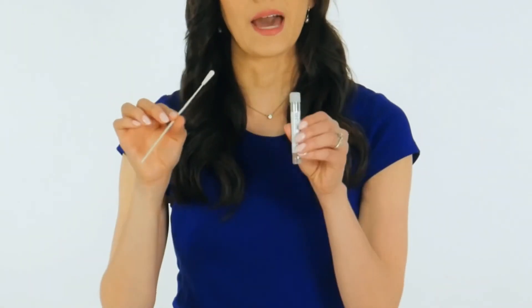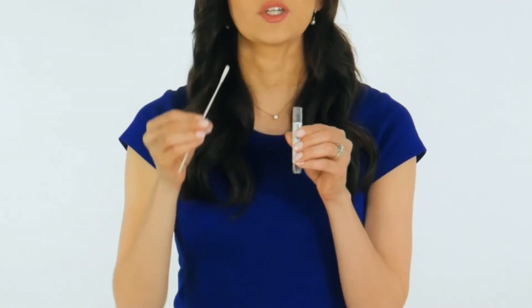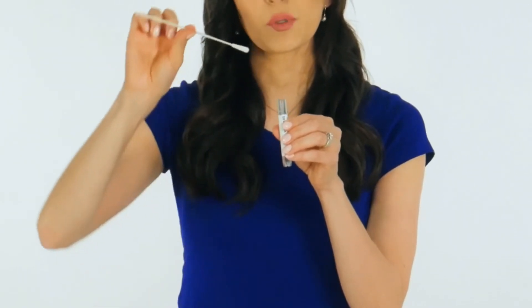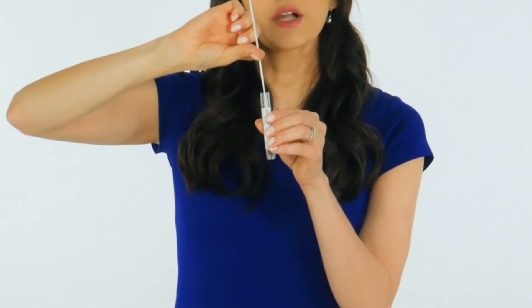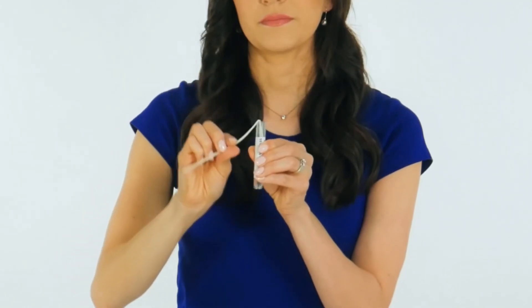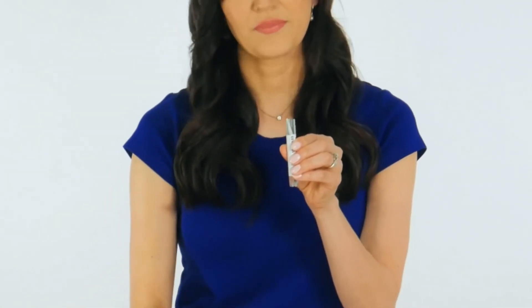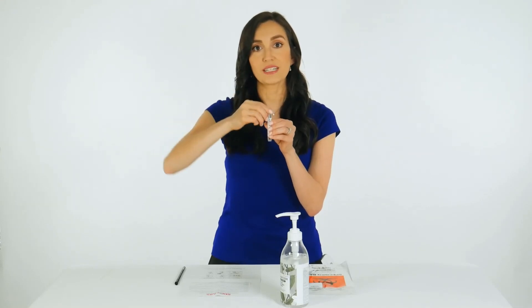While holding the swab in the same hand, unscrew the cap from the tube. Do not spill the contents of the tube. If the contents of the tube are spilled, use a new swab specimen collection kit. Immediately place the swab into the transport tube so that the score line is at the top of the tube. Carefully break the swab shaft at the score line against the side of the tube. Immediately discard the top portion of the swab shaft. Tightly screw the cap onto the tube. Return the tube as instructed by your health care provider.